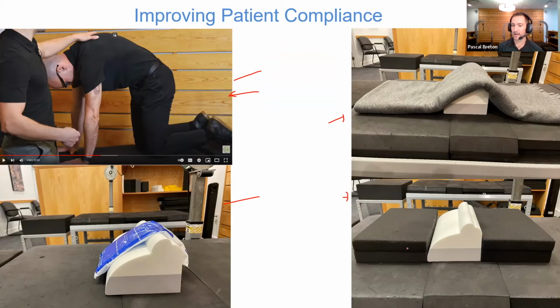So here I have these foam blocks that I use for my traction setups in the clinic. Those are soft foams, okay? They're compressible, so it's not like a rigid foam or anything. So patients at home could interchange this with just folding up a couple towels. But I have them fold a towel at the base of the Denneroll, fold a towel behind the Denneroll.